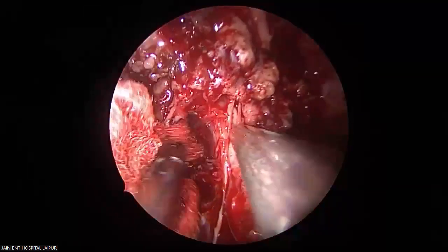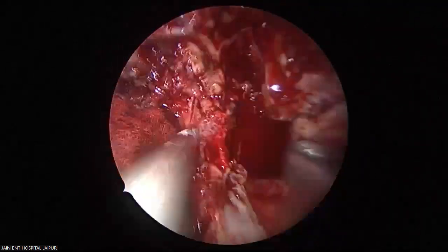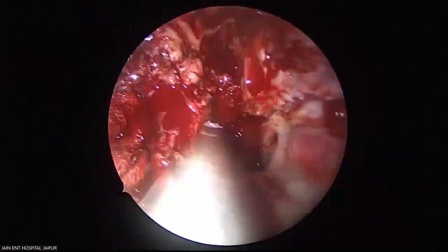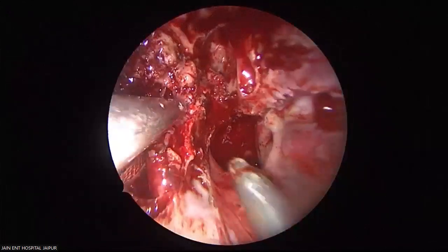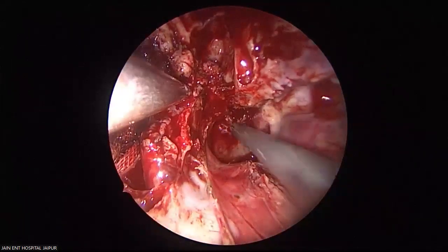So I'm leaving this gauze for a while. Now we have an important point. This entire pterygoid is involved in the tumor. So that is to be resected, and these are the potential areas. If we even leave the smallest part of the tumor, there is a chance of it coming back.